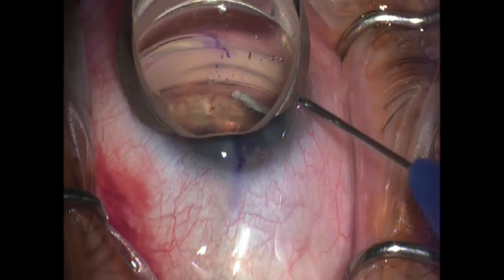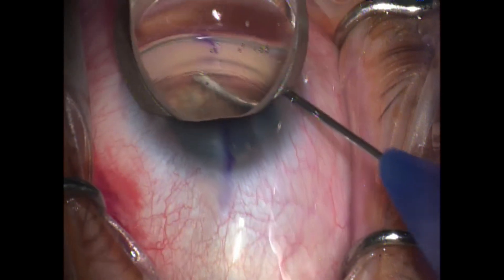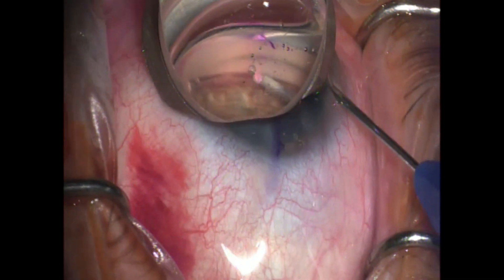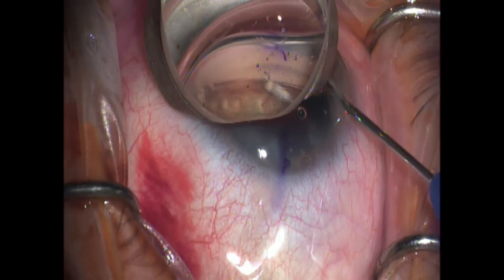I use this bevel tip to score the trabecular meshwork. By scoring the meshwork and pulling down a little bit, you expose the canal, and that makes it easier to get the tip of this cannula into the canal.